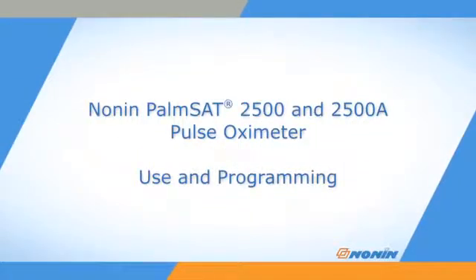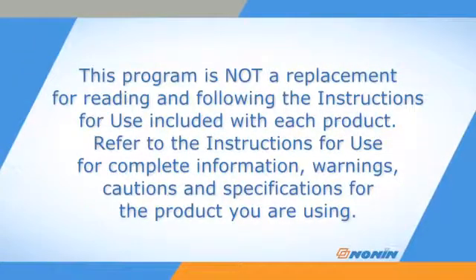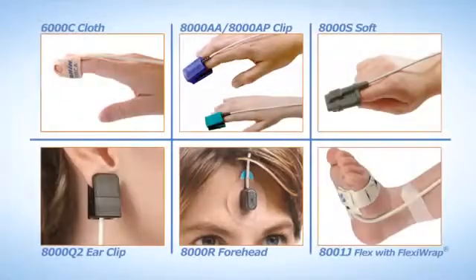This short video shows how to properly program, connect, and operate Nonin PalmSat Model 2500 and 2500A pulse oximeters. The PalmSat 2500 and 2500A oximeter models are designed for portable oxygen saturation and pulse monitoring, and are compatible with the full range of PureLight sensors from Nonin Medical.